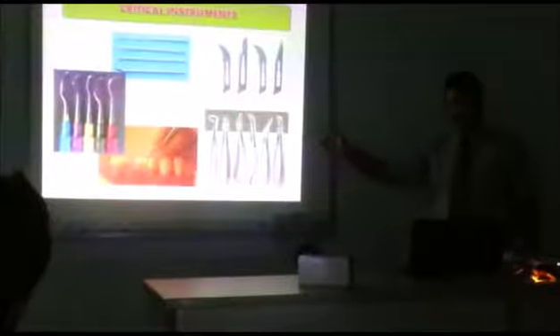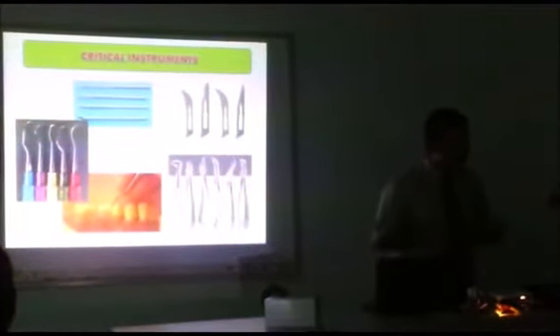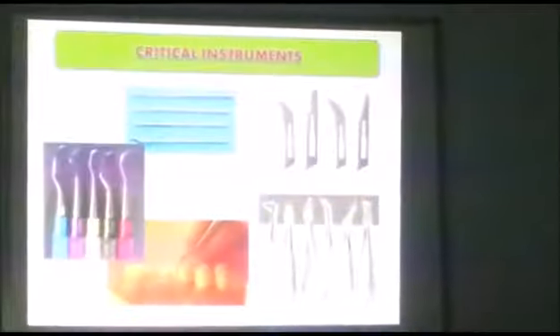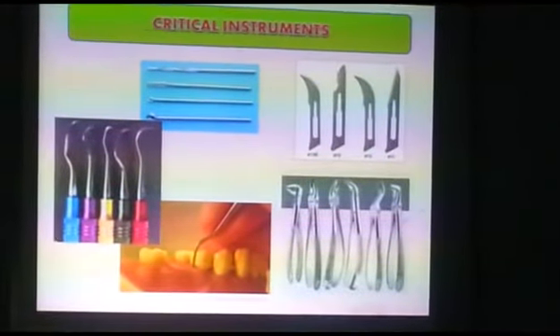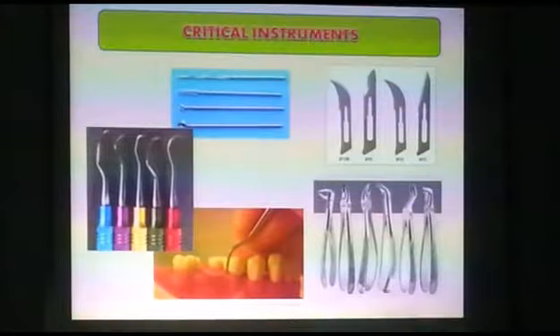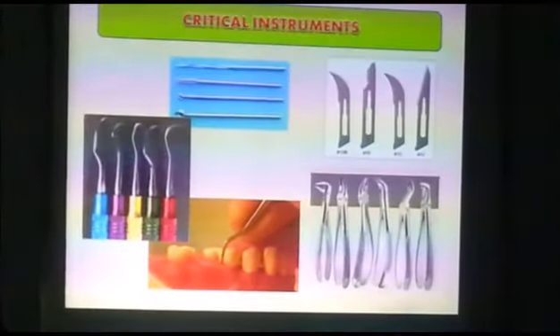Dental pliers, surgical pliers, forceps, and curettes. I think most of you are familiar with these instruments. As you know, these instruments can penetrate the mucous membrane and communicate with blood, bone and other sterile tissue. This makes them critical instruments, because they have a high risk of disease transmission since they communicate with blood.